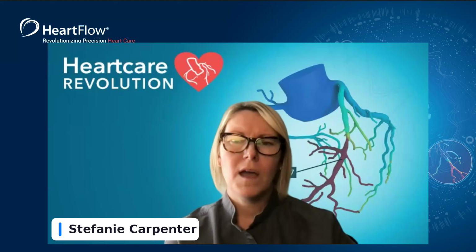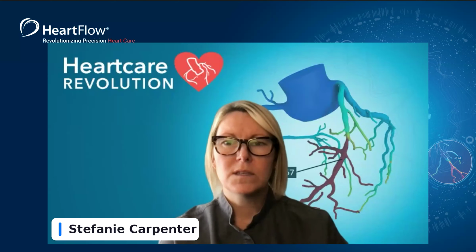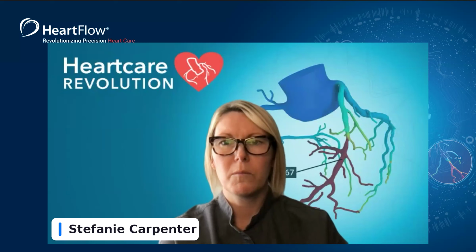Yes, so if they have an arrhythmic heart rate, typically retrospective scanning is going to be the best option for that. We like to have multi-phase data. So if you can send systolic and diastolic phases, like 40 to 80 by 5% intervals, and then possibly millisecond reconstructions as well, if you have that option on your scanner. Not all scanners have that available, but if you have a millisecond reconstruction.